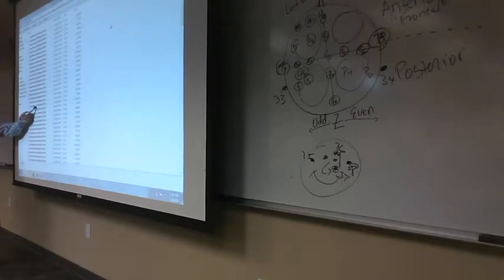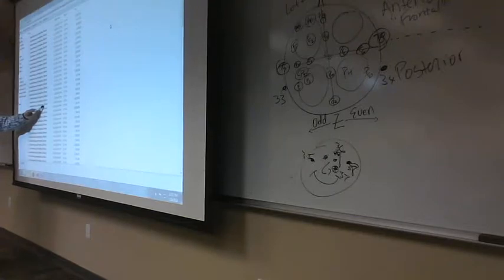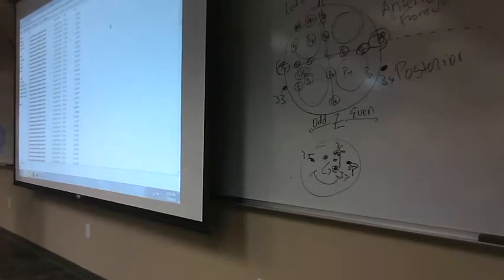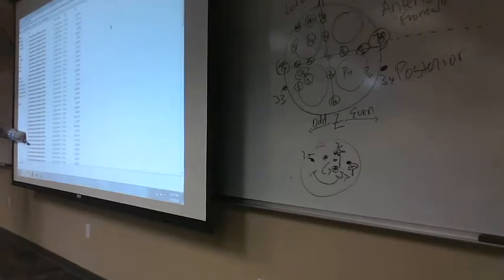Then we also know that there's a 0.1 hertz high pass filter applied, just like we've done in class. And then we know that it was downsampled to 256 hertz because it says 256 hertz. So we know that this was done for every single subject. It looks identical because I used a script that looked just like yours to crush it through. And then I went and I had a margarita. Make sense? Okay, so this is the output. This is the end game of what your script is going to give you, because these are the same steps we did, right?